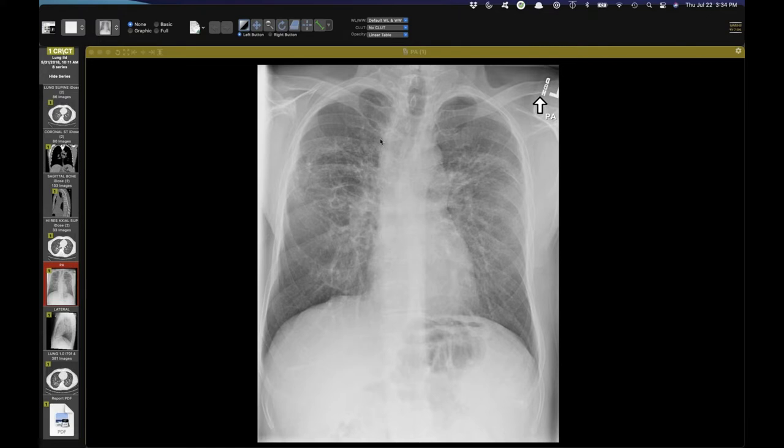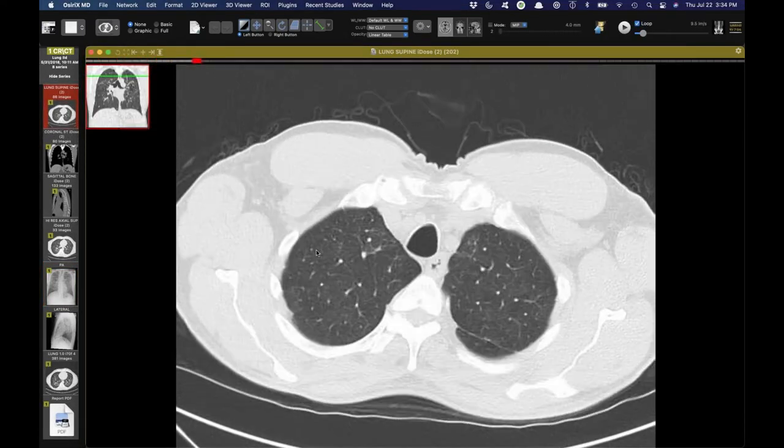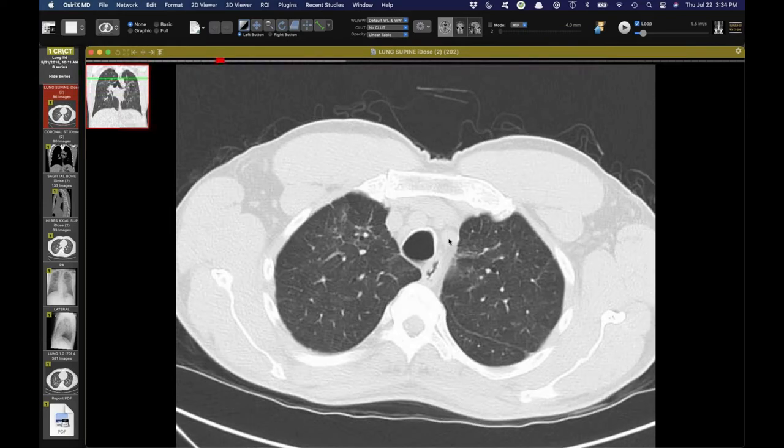You can see, I think the radiograph helps show some upper lobe volume loss. The hila look like they're elevated superiorly and some of these lower lobe vessels look a little elongated. I think you'll see it's a fairly symmetric process, but I will show quickly this is the first CT, thicker sections. And then this is at that time, just to show that things haven't progressed that much. I'll show a thinner slice study.